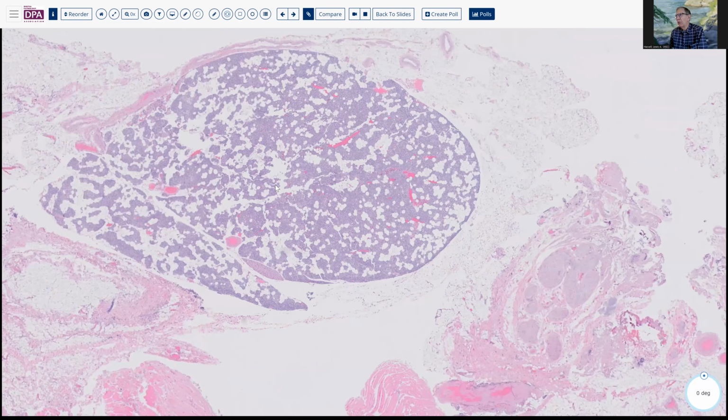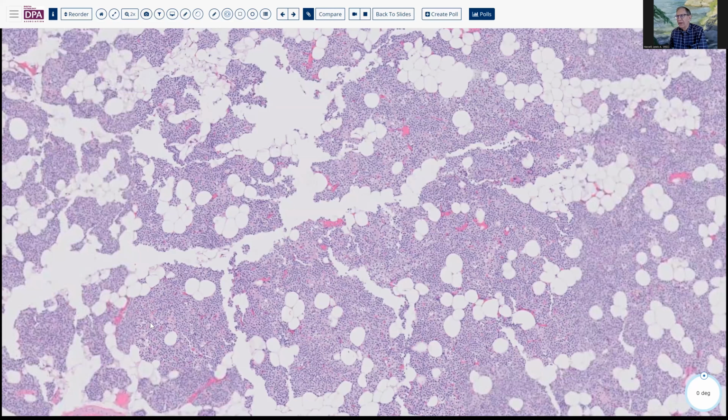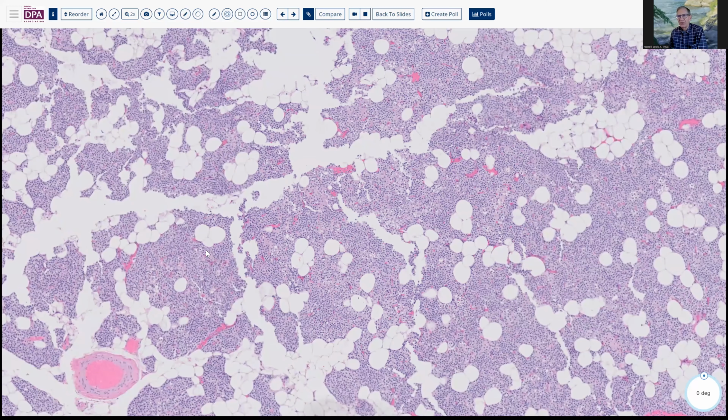The normal parathyroid contains quite an abundant amount of fatty tissue, so much so that it may occasionally be almost inconspicuous to find the parathyroid tissue. Sometimes surgeons will sample a little lobule of fat, thinking that that is the parathyroid.